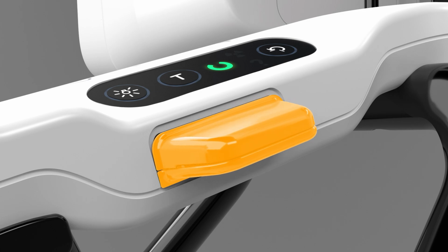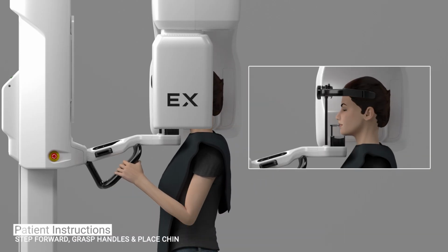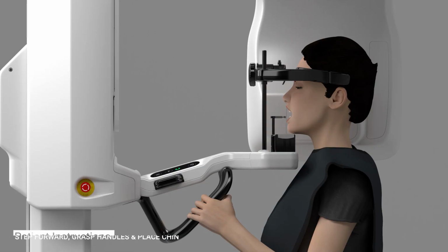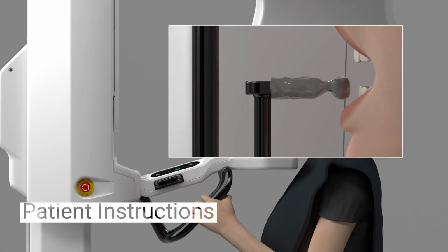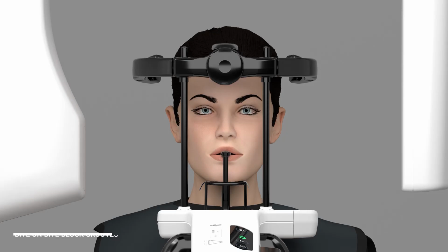Have the patient step forward, asking them to grasp the patient handles. Place their chin onto the chin rest and bite on the bite block so that both their upper and lower anterior teeth are in the bite block's grooves. Tell the patient to close their eyes. Turn on the patient positioning lights by pressing the positioning light button on the control panel.